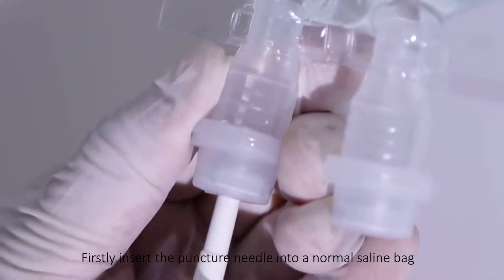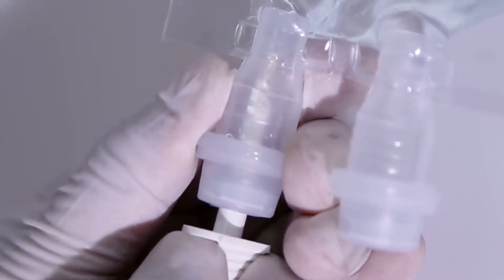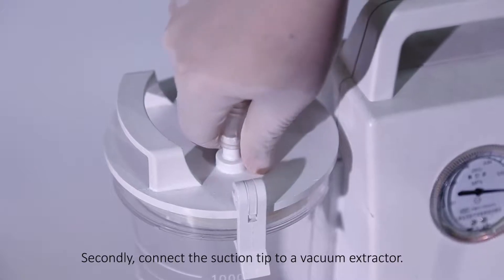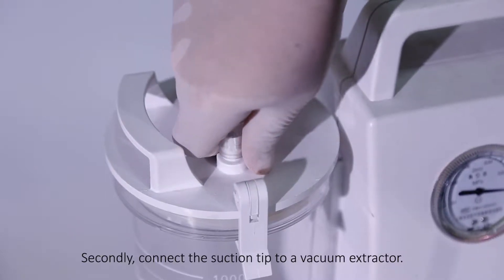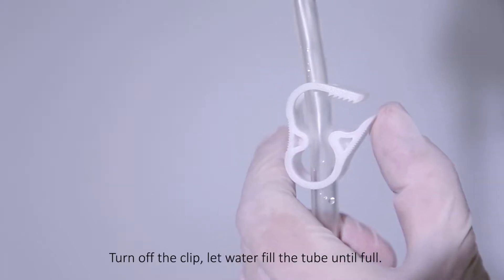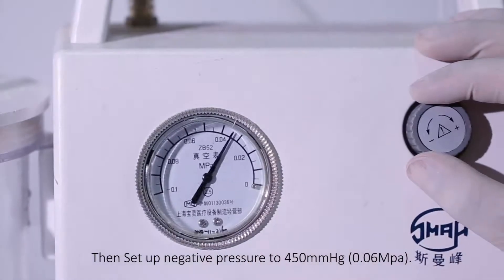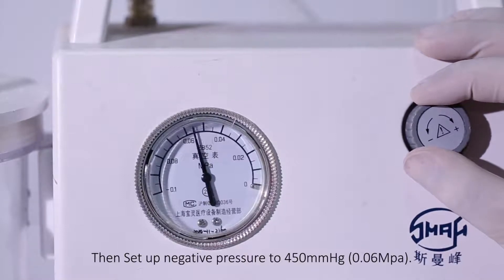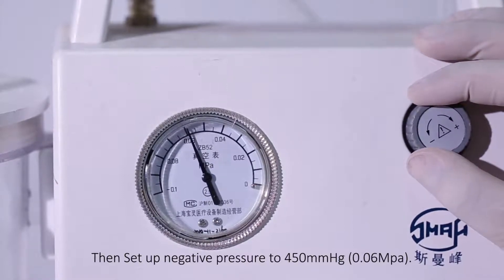Firstly, insert the puncture needle into a normal saline bag. Secondly, connect the suction tip to a vacuum extractor. Turn off the clip, let water fill the tube until full, then set up negative pressure to 450 mmHg or 0.06 MPa.